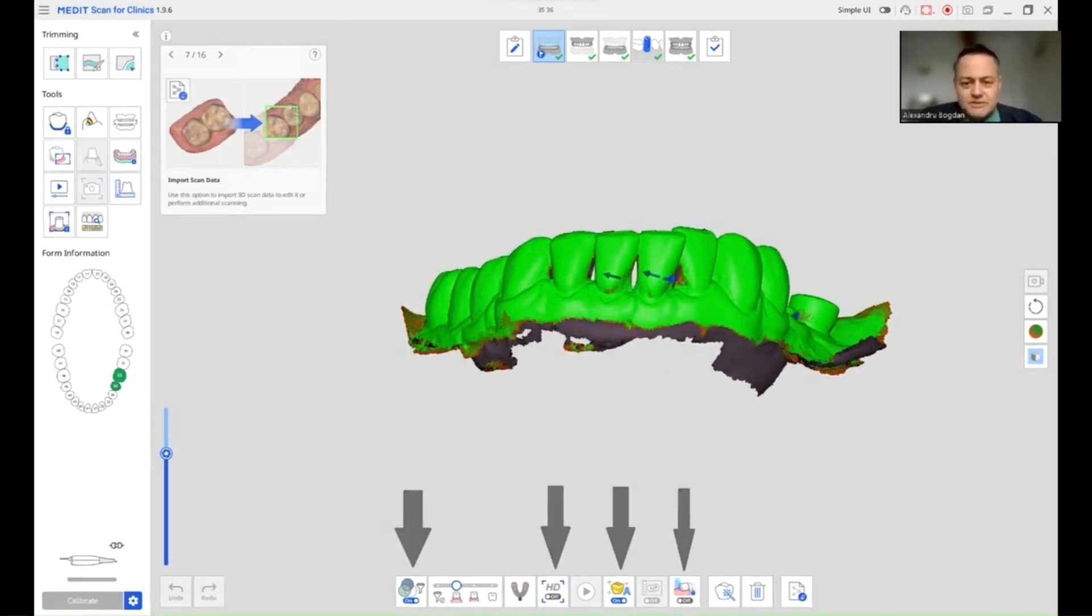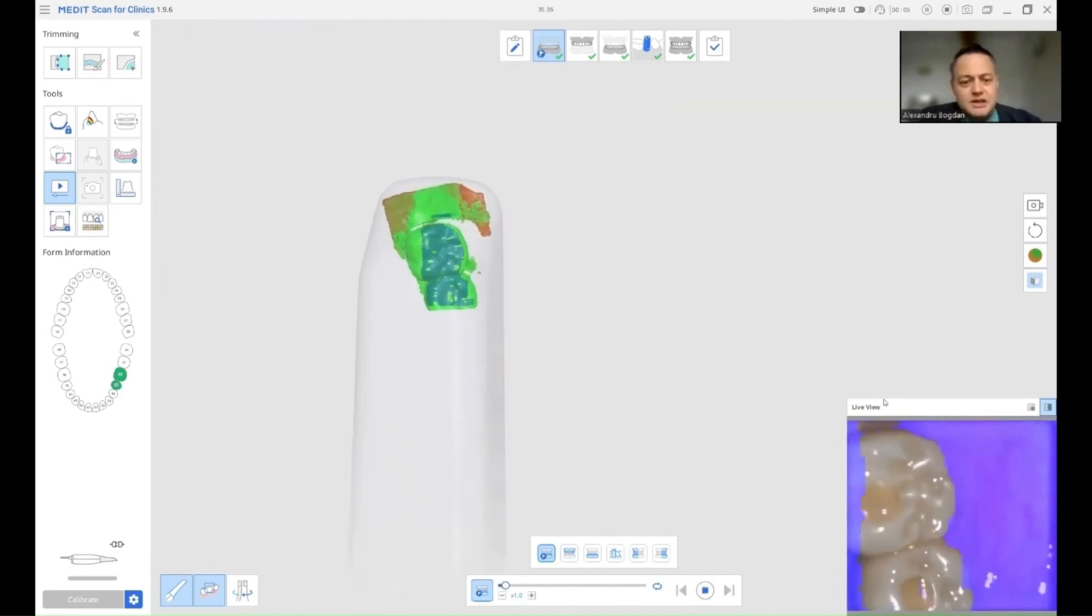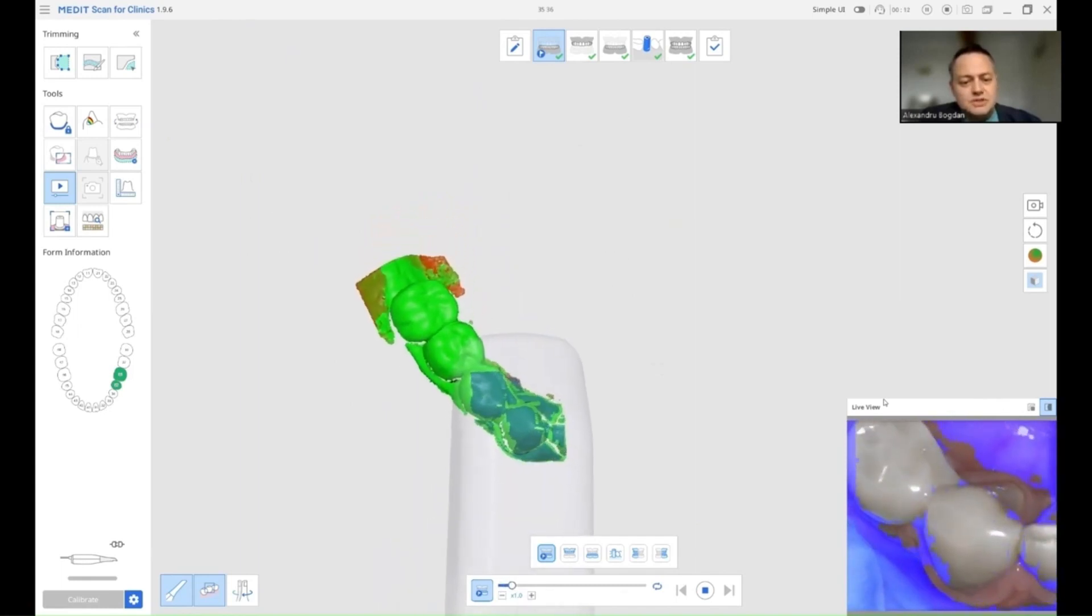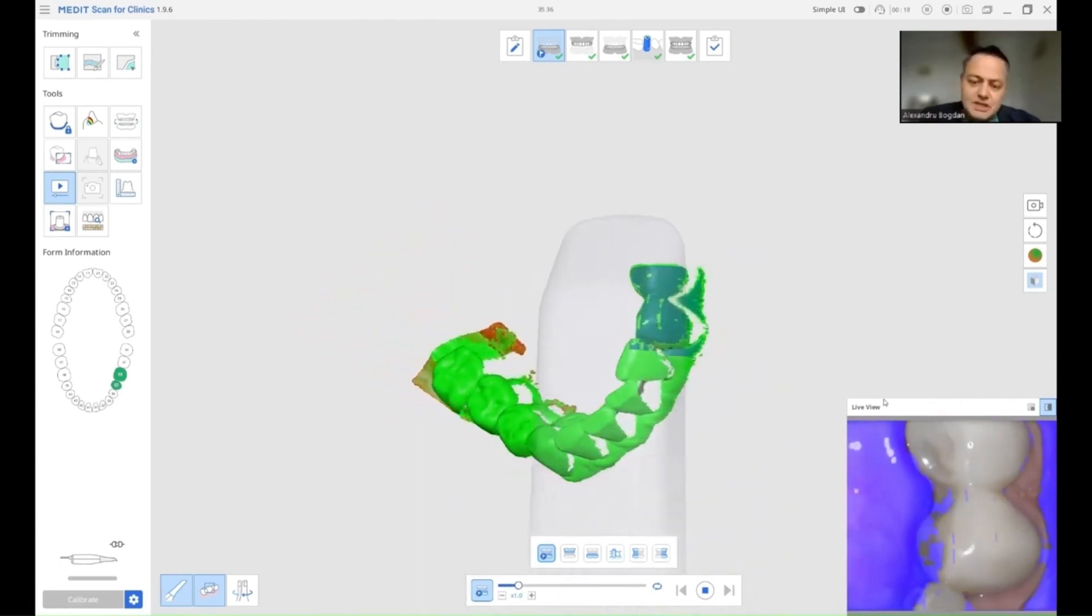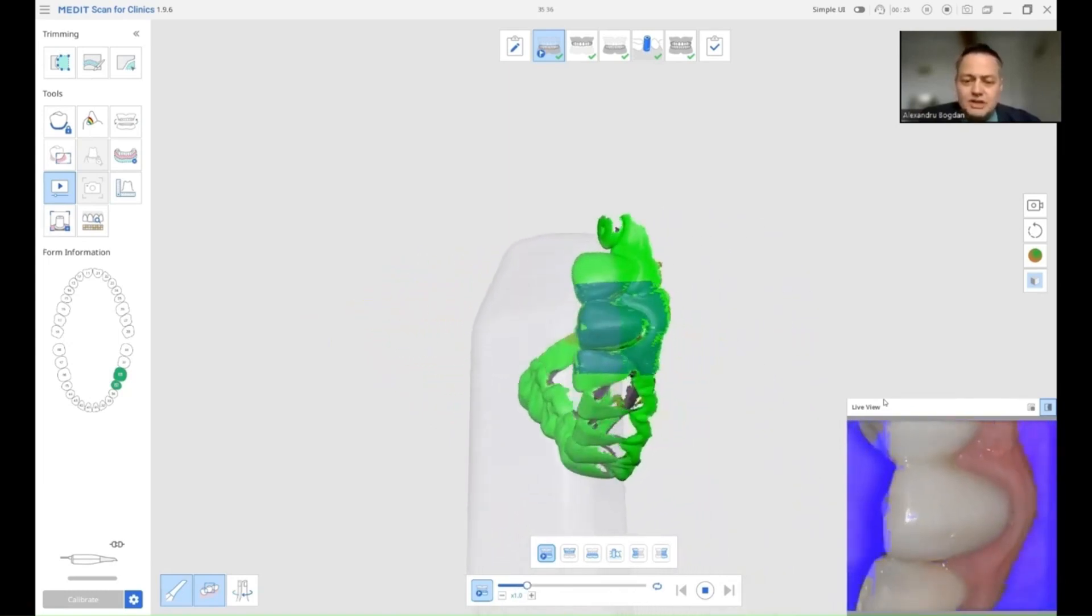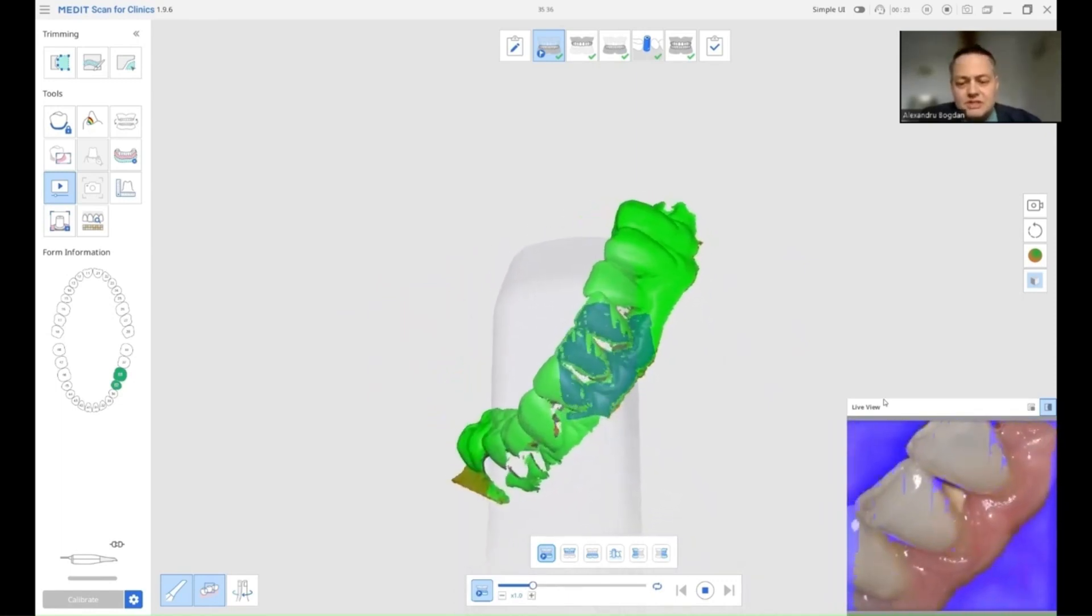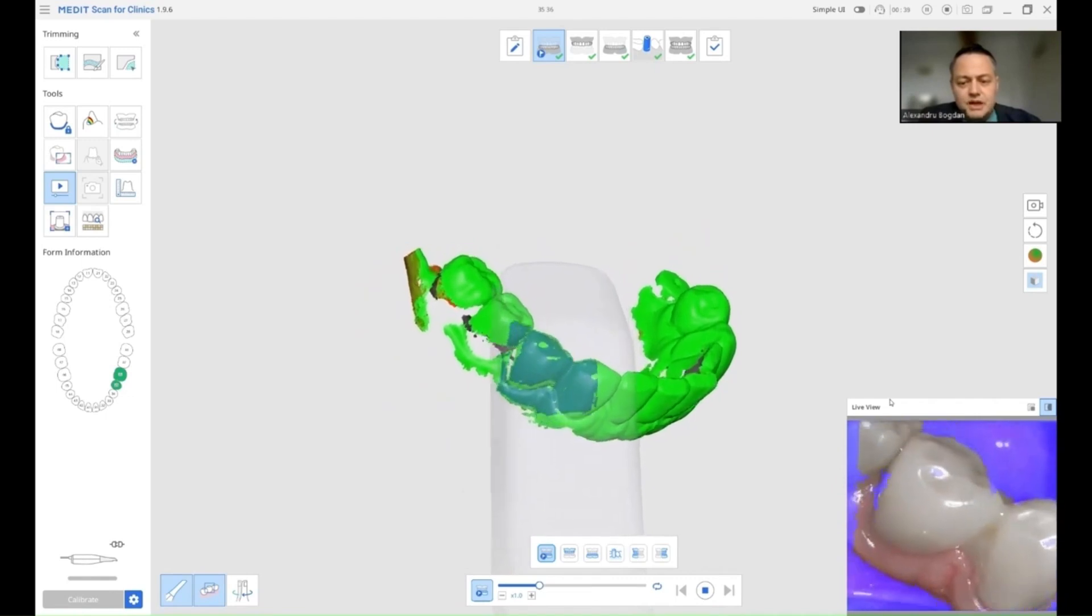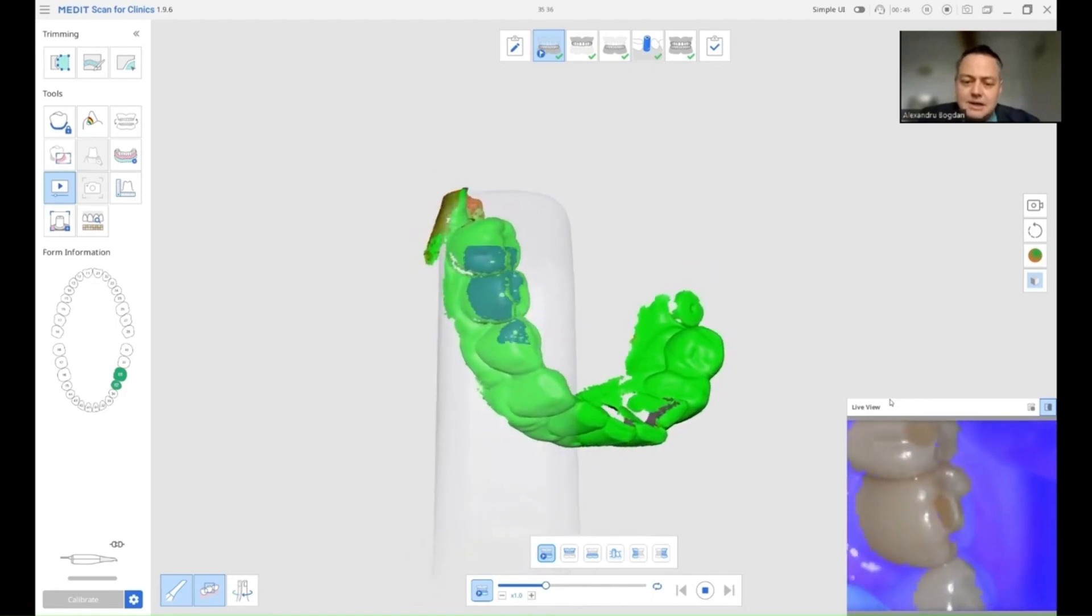For the first thing I will do, I will start taking the scan of only the teeth. I am going to start with the occlusion surface of the molars from the contralateral side. As you can see here in the incisal, I hover over and do an angulation between buccal and lingual to get enough information of the crowns, occlusal surface, and some parts of the papilla. Then I am going to go lingual and vestibular to get my buccal scan.